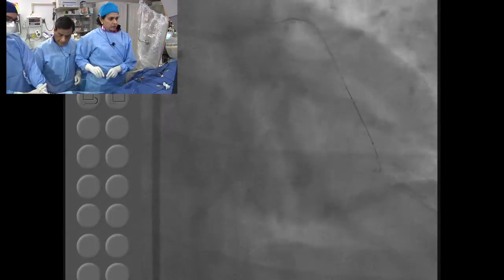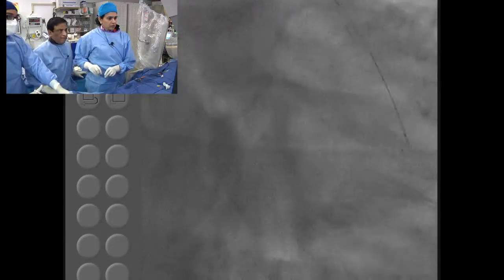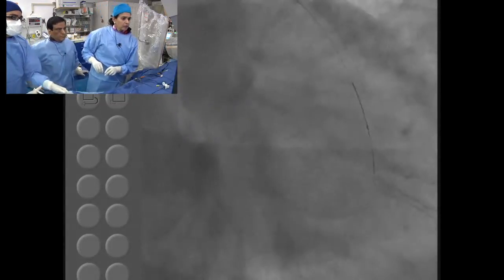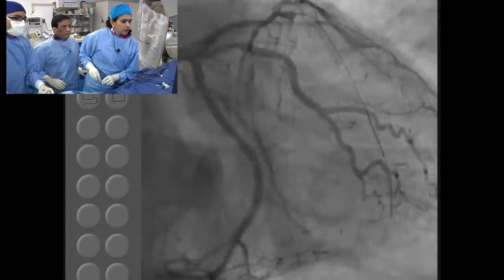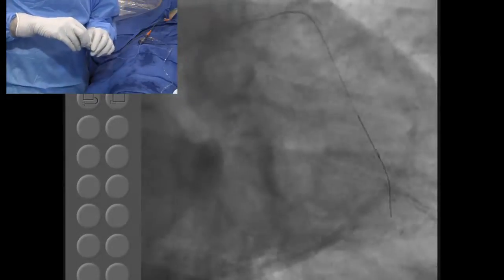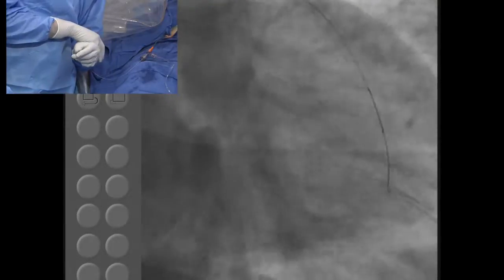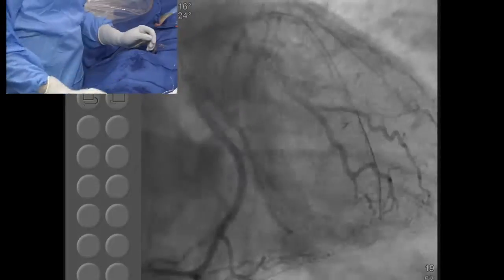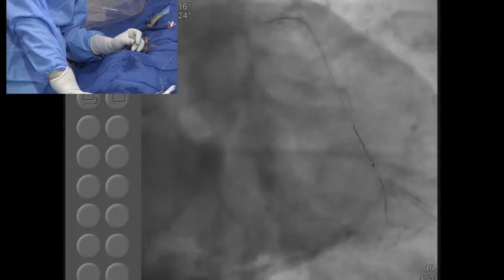Yeah, to take a run here. Large mag, 1 second, further mag. Oh, you may not be able to see. No, this one. Yeah, it's subintimal there. The question is, at what level did we become subintimal?